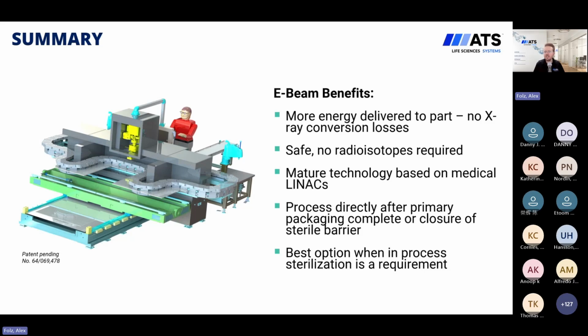LINACs are a mature technology, based on medical LINACs used for radiation therapy and other treatments. With the short processing time, this allows us to process directly after primary packaging is complete or closure of the sterile barrier. And along with that, this is the best option when in-process sterilization is a requirement.